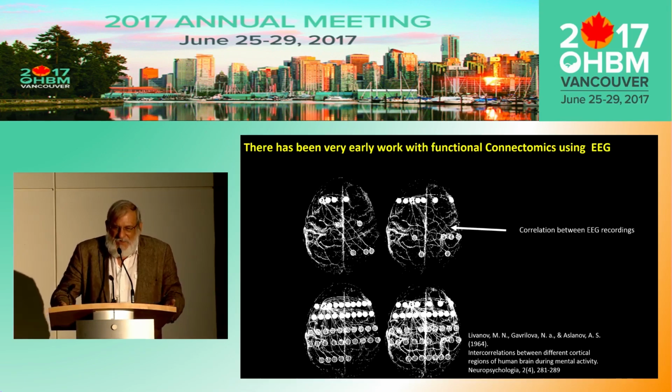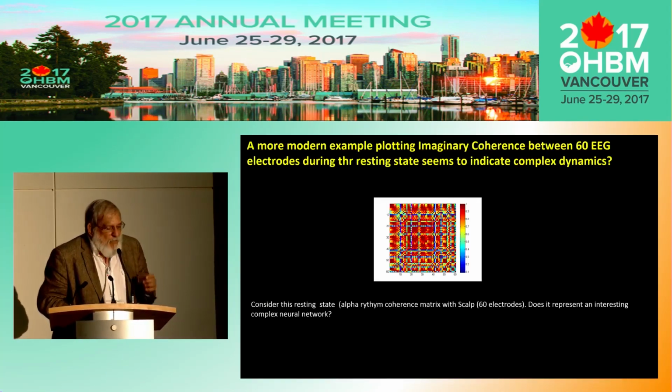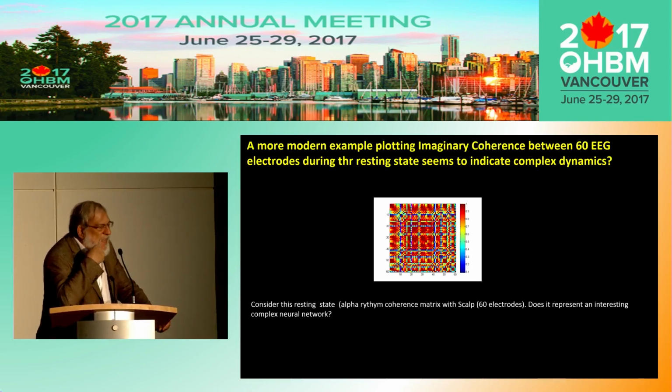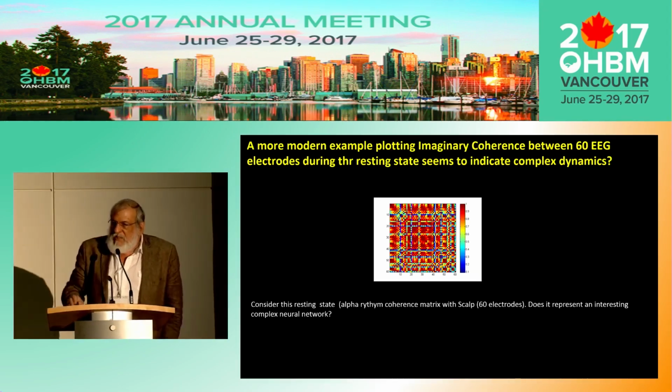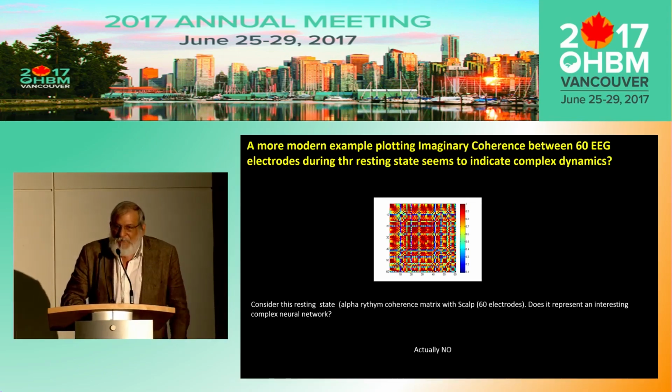And here already we have the question, does this reflect the brain? What does it mean to talk about functional and effective connectivity? So I'll talk about the problems, but I'm going to first hammer in some ideas. Here is a more modern version. I actually did this. This is the imaginary coherence for 60 electrodes in a person at resting state. And one of my students had fun, went into the graph theory, came out with small world things. Is this interesting? Well, I don't think so, and I'll show why.